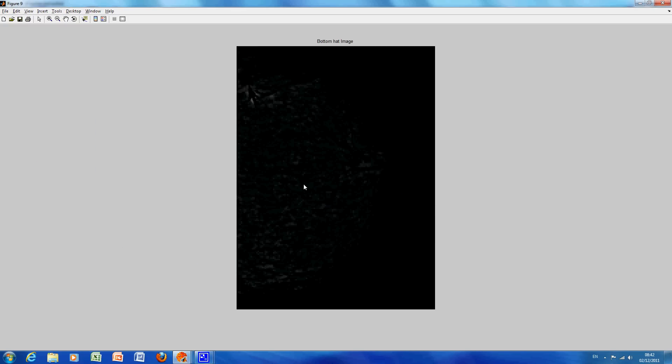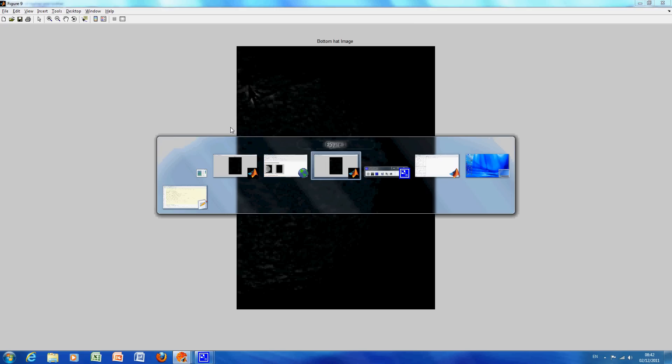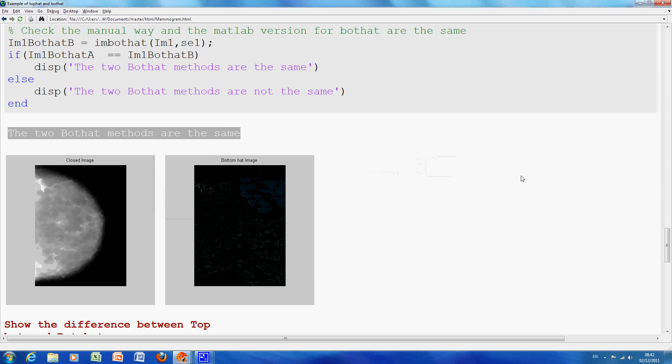Just look at the BotHat here. Now, that BotHat image there, hopefully you can see this on YouTube, but the little white bits, they are, I know they're white, but they actually represent the dark bits of the image. So, they are the little white bits there. You can see a few of them there and up there as well. So, they are the intensity troughs. Okay, I'm going to explain how that works in a sec.